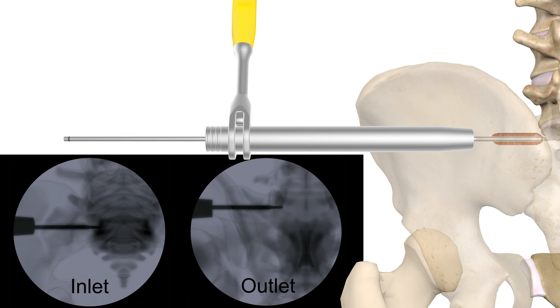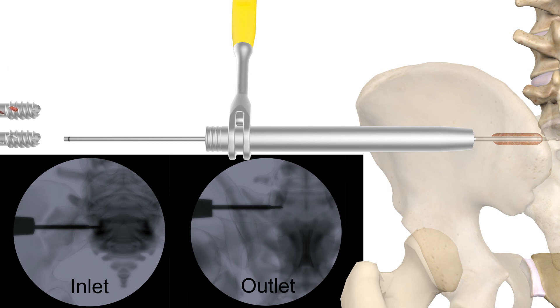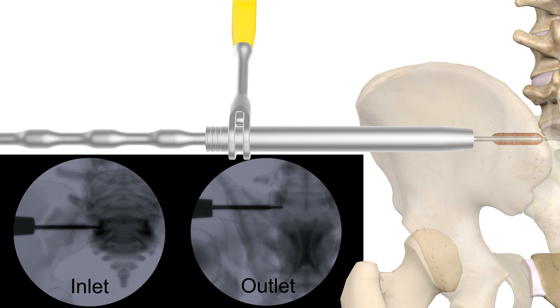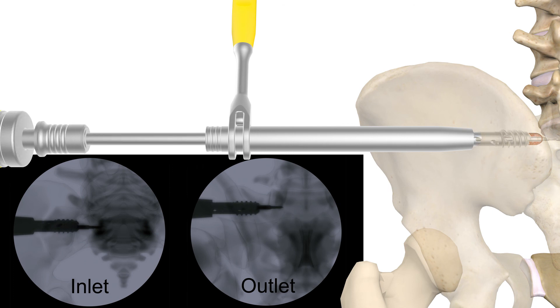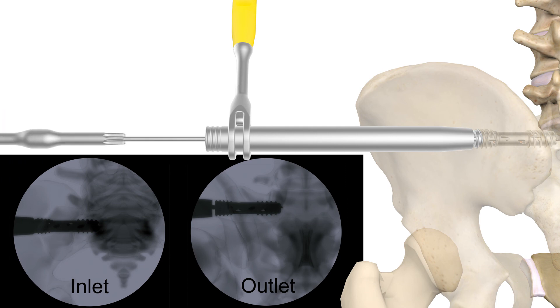Load the implant using the stab and grab inserter. Then place an extra guide wire into the implant to aid in packing the harvested graft into the fenestrations. Remove the extra guide wire in preparation for implant insertion. Slide the implant down the placed guide wire through the dilator and begin inserting the implant until the laser mark on the inserter shaft meets the proximal end of the dilator.